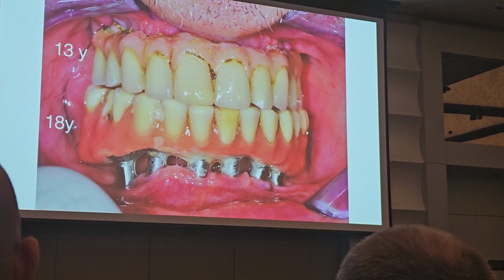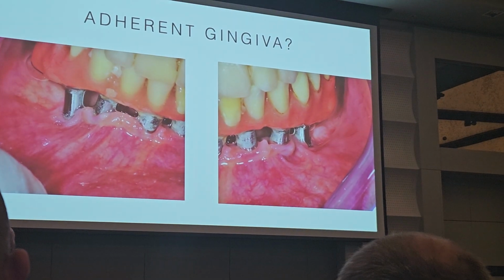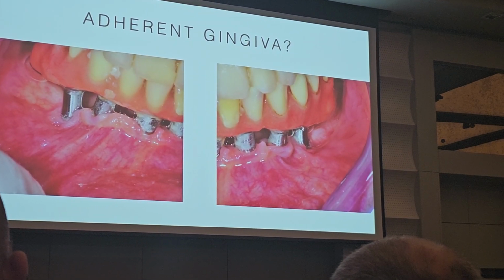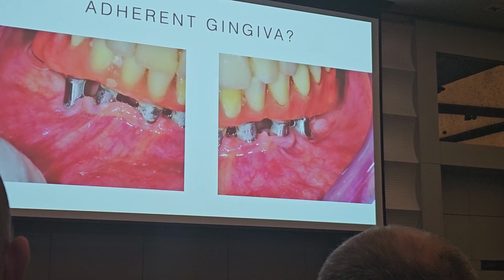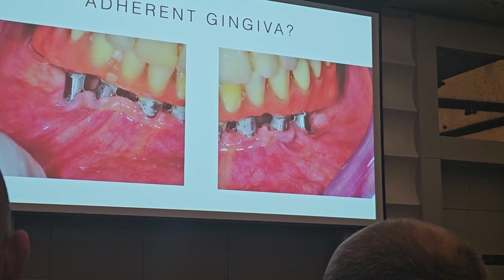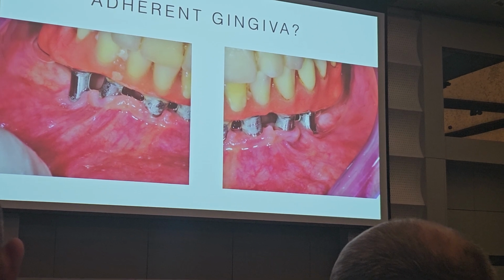I recognized him when he entered the office. Of course, the soft tissue is in good condition. Still, I have no attached gingiva. You can see, no attached gingiva, but after 18 years, with zero hygiene, the implants are fine. So honestly, I don't think attached gingiva is mandatory for implants. This is my experience. It's important to have immobile gingiva, that is another thing.